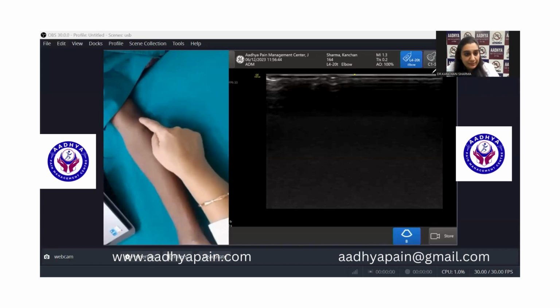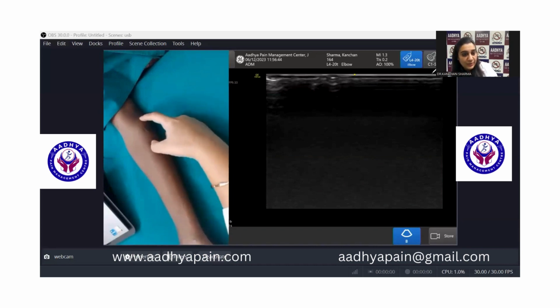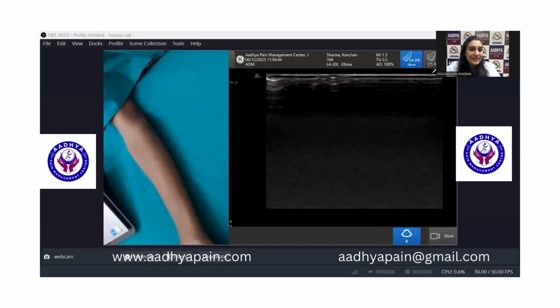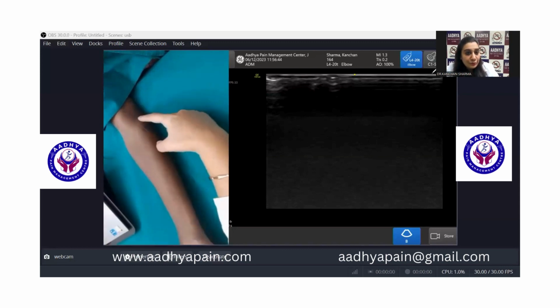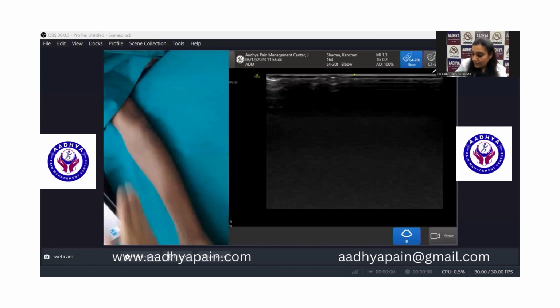You palpate the medial epicondyle and put your probe in the craniocaudal direction. Once you have done that, you will see the common flexor tendon, but only a very small tendinous portion of it. If you want to look for a good tendinous portion of the common flexor tendon, you need to rotate the caudal end of your probe. This is the caudal end of the probe, which you need to rotate and bring in line with the index finger. In that condition, you will be able to see the tendinous portion of the common flexor tendon very nicely. So this is what we are going to do now.